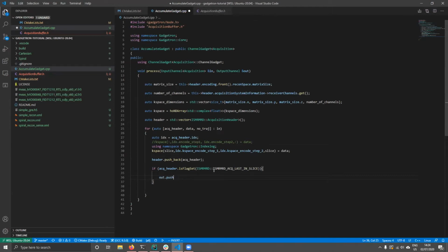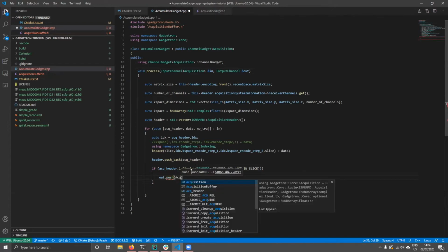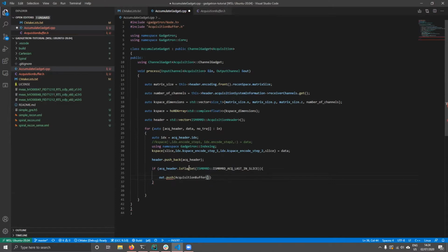So the way we send things on is we have the output channel and we just push things onto the output channel. We make an acquisition buffer, and it takes the K-space and the header. Let's call that headers to actually tell what's in it. And this move thing here, if you're not familiar with C++, what it does is it takes the data inside K-space and moves it into the acquisition buffer. That way we avoid having to copy anything.